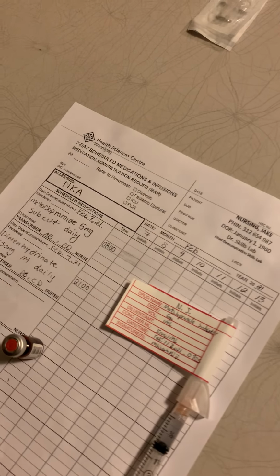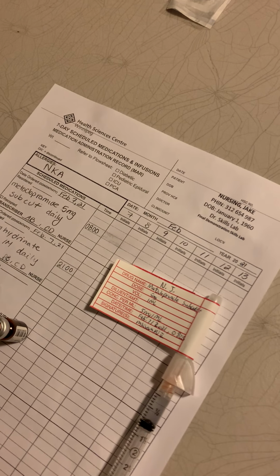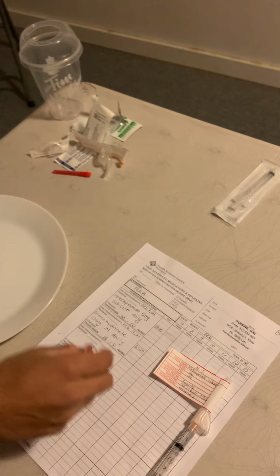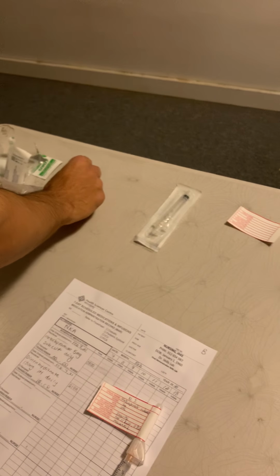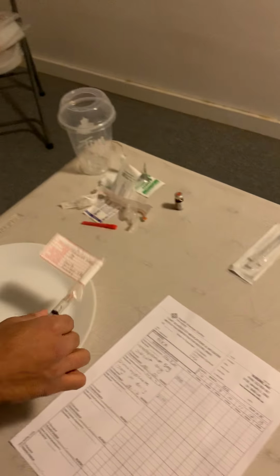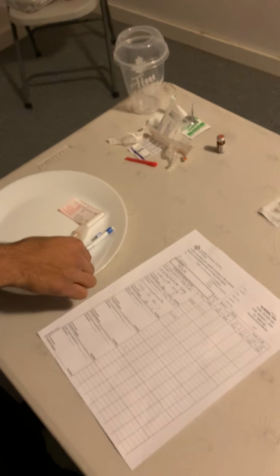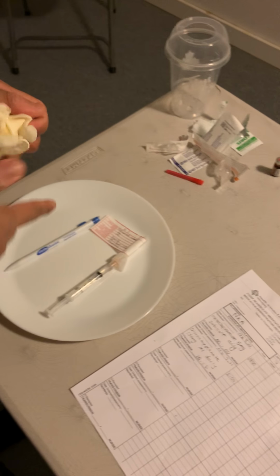Right now the time is 0825. This has not been given, and so I can go ahead and administer that. Okay, now that I have done that, I'm just going to discard this vial. When getting my supplies for my patient's room, I'm going to be needing my syringe. I am going to be signing the MAR with a pencil just for demo purposes, but in a clinical setting, I would be signing with a black pen. And I'm needing my clean gloves, alcohol swab, and cotton pad.